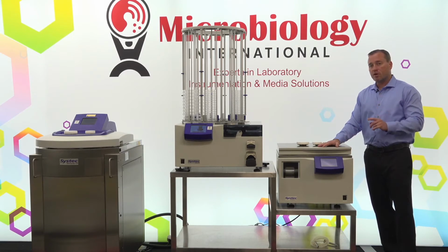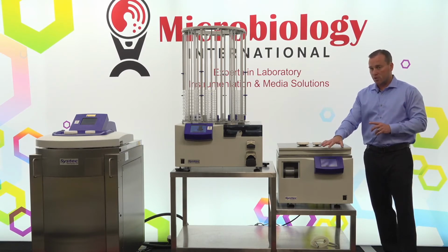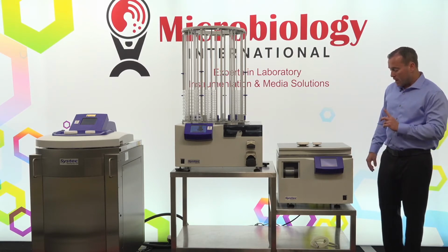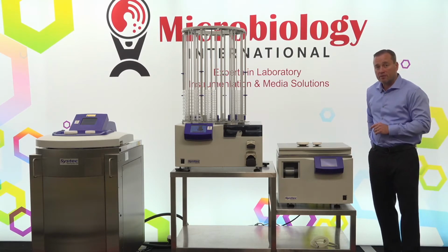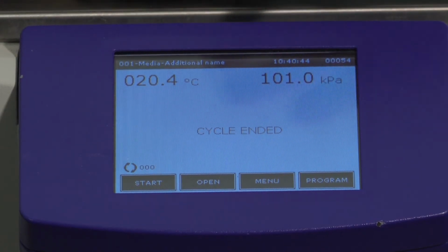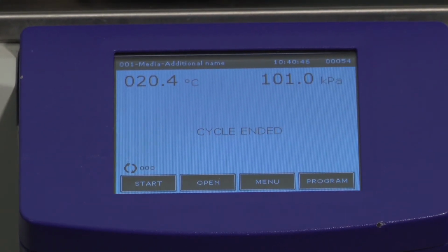So give us just a brief moment to get our camera into position so we can get onto the screen, and then we will run through the programming and the setup on the screen. This is the home screen that you would see on the system normally. On the top of the screen, what you would see here is the actual cycle that we are running.